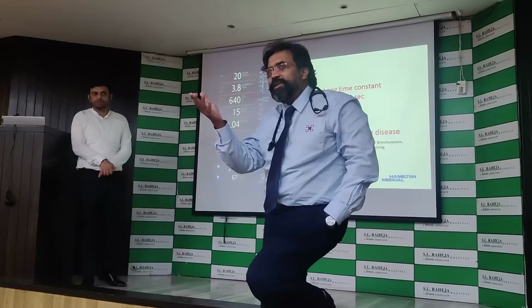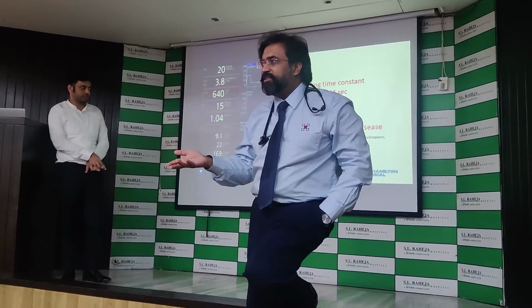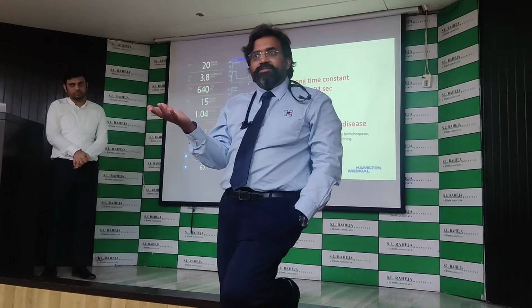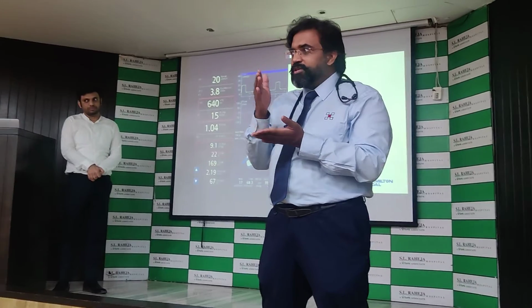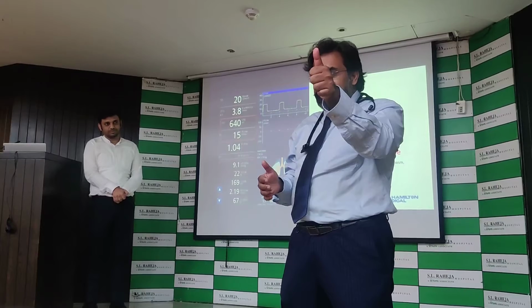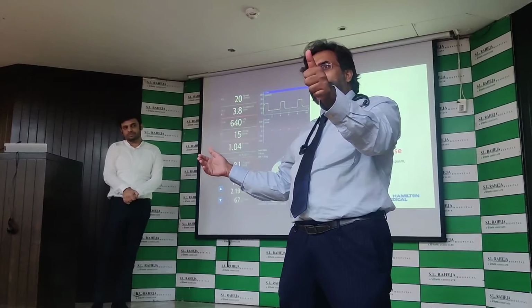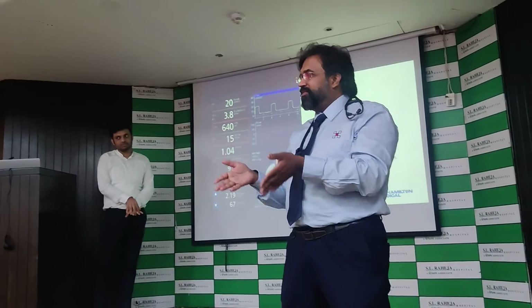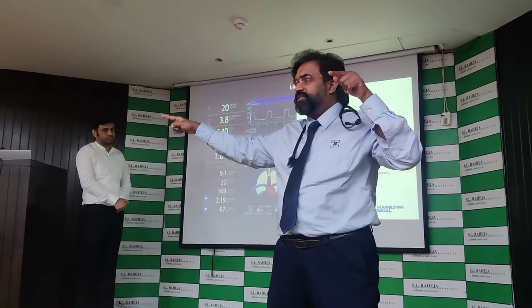And that's why you must also understand why plateau pressure is not the right pressure: because time constants are different for each alveolus. Your plateau pressure is monitored when flow is 0. When you press inspiratory hold, you're making the flow 0. There will be certain alveoli that are still filling because they have longer time constants, and certain alveoli that have already finished emptying. At the end of the day, your flow is not 0. That is why sometimes in ARDS patients, the plateau pressure takes a very long time before you get a graph that is straight.